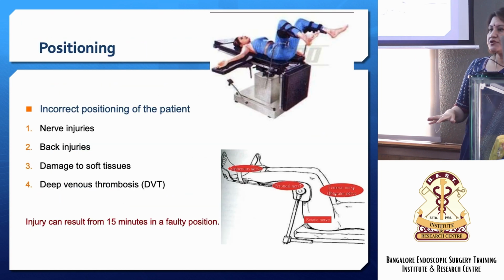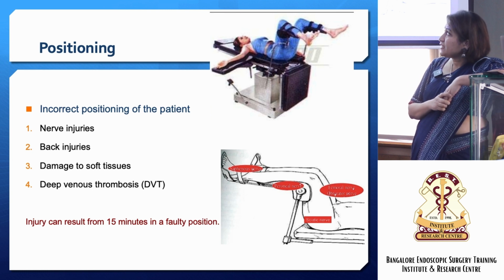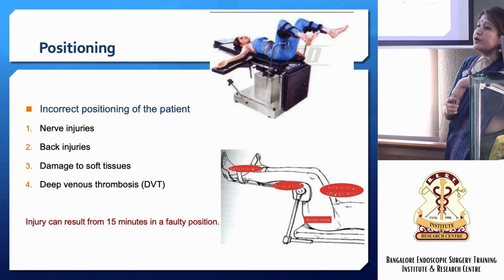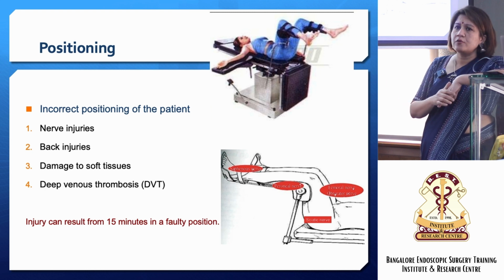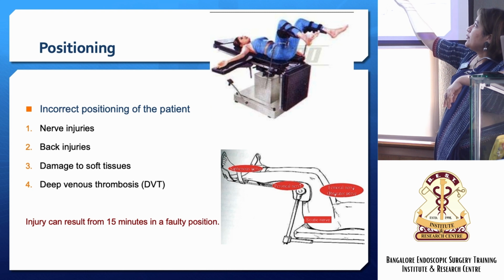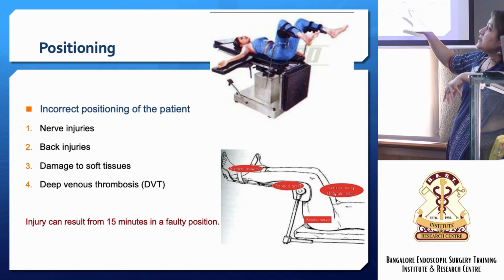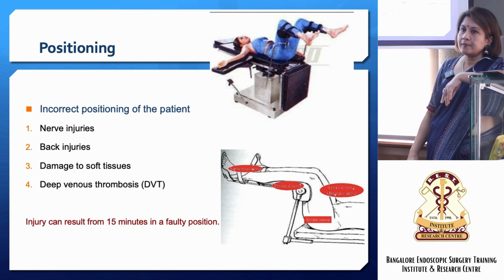Now coming to the position, all of us are aware that we use a lithotomy position. Particularly, you need to take care if you're doing an operative hysteroscope or even a laparoscope, when you have to make sure that all the pressure points are taken care of. Otherwise it can lead to nerve injuries. So you need to specifically take care the patient is comfortable at all the joints when we are performing the hysteroscope.